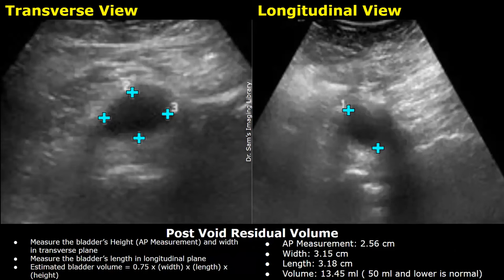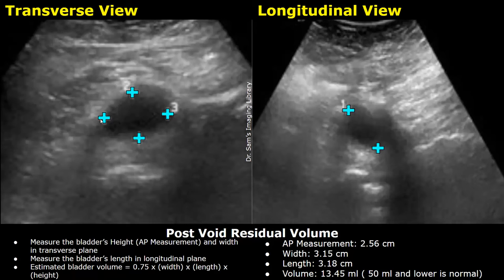These are images of the bladder after urination. The bladder dimensions are measured in the same manner as shown previously. In the transverse view, the height is measured by placing one caliper at the anterior wall and the second at the posterior wall. The width is measured by placing the calipers horizontally across the bladder, and the length is measured in the longitudinal plane to obtain the longest dimension.